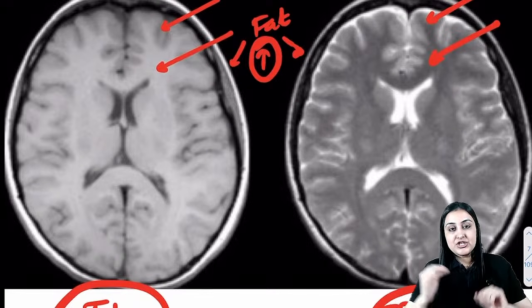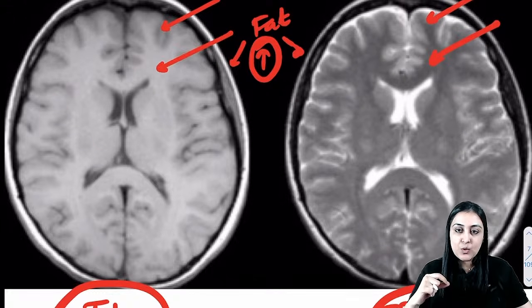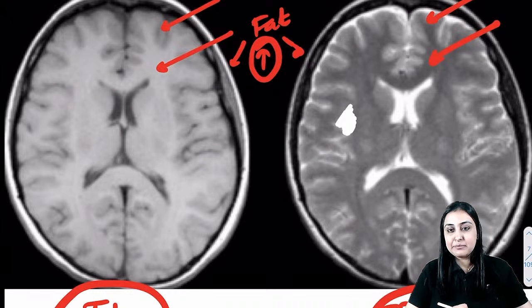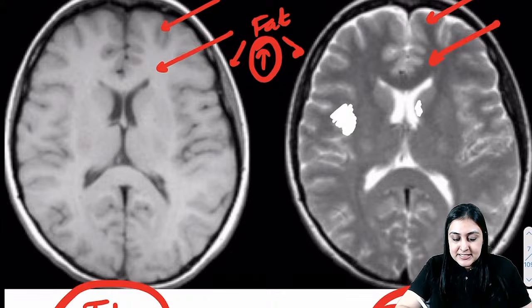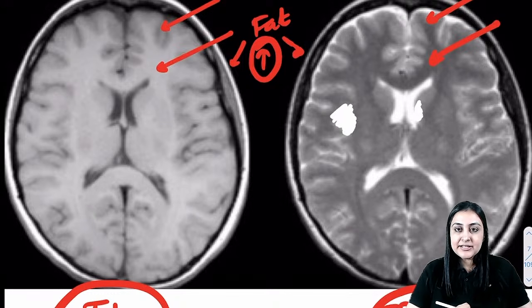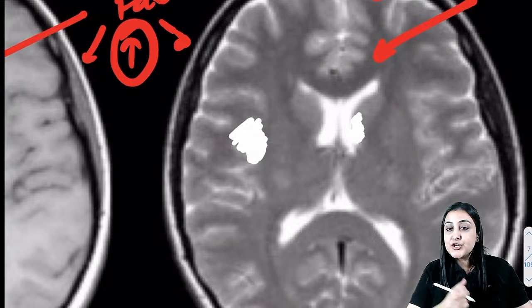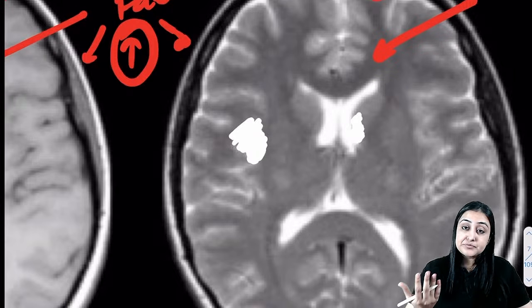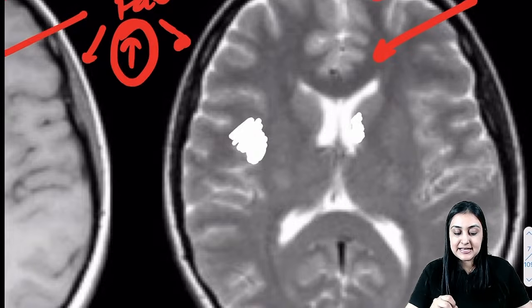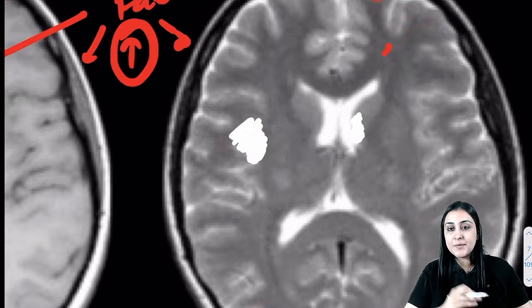Now what problem happened? The problem was that any brain pathology is going to elicit edema. Edema is water. Water is going to be white on T2, right? So can I say that any pathology in the brain is going to elicit its edema? It's going to appear hyperintense, yeah? So this was good. I could pick it up on T2 also. But a problem came when I saw that there is a very subtle periventricular hyperintensity in a disease called multiple sclerosis. In multiple sclerosis, we have demyelination. So now what happened was it had these periventricular edema. It had these periventricular hyperintensities. So do you think I will miss this on T2 because it will merge with the fluid if it is very small? Yeah. So to basically solve this problem, we thought to ourselves, let's make the CSF black. Let me make CSF hypointense such that any edema now becomes very, very apparent.